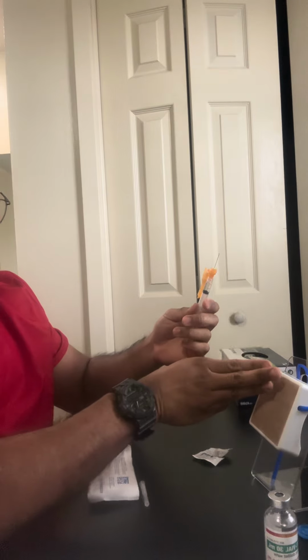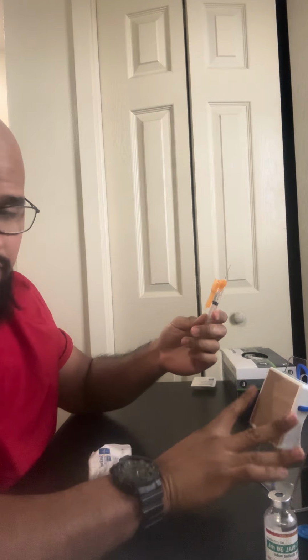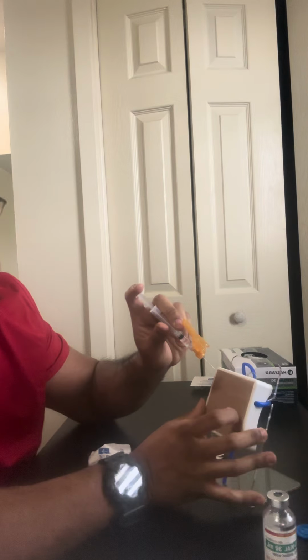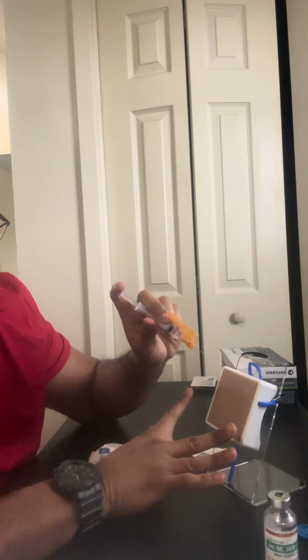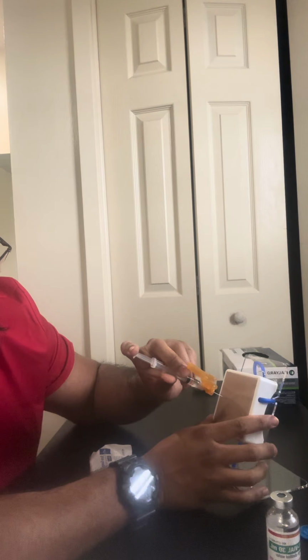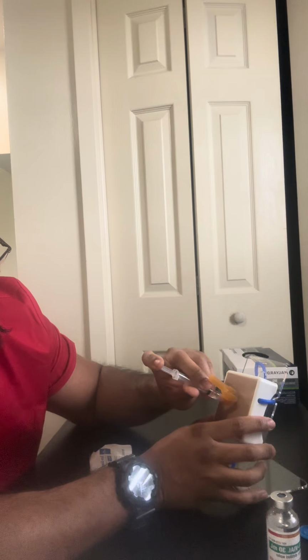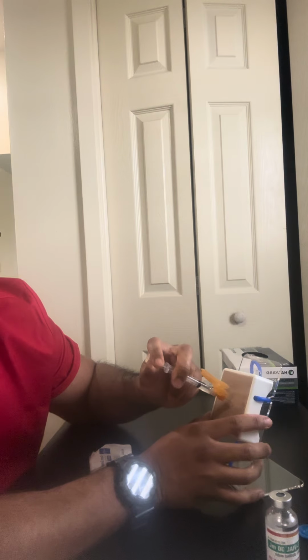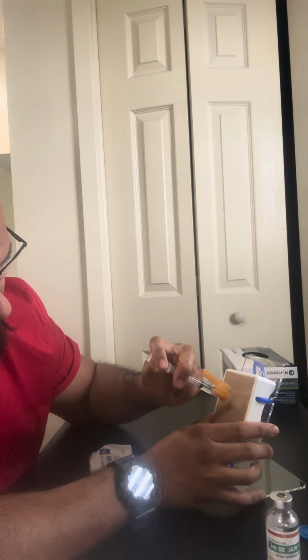Use that 3-finger method to confirm the right placement, like I showed you a while ago. Then from there, this, for instance, would be his shoulder, and we already have the skin nice and taut. You go straight in, and then you aspirate. Make sure you don't get any blood return. And then from there, you inject.